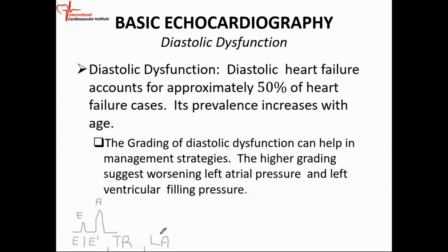Patients with grade 1 diastolic dysfunction are less severe. When you have grade 1 diastolic dysfunction, you have a problem with relaxation. As the diastolic dysfunction gets worse, you move from abnormal relaxation to where the heart is stiff; you have a problem with compliance. So initially, the heart doesn't relax properly, okay? And when you look at your E to A, the E is going to be smaller than the A. Your E to E prime ratio is going to be less than 15, medial E to E prime ratio, okay? So that 15 is a very important number.